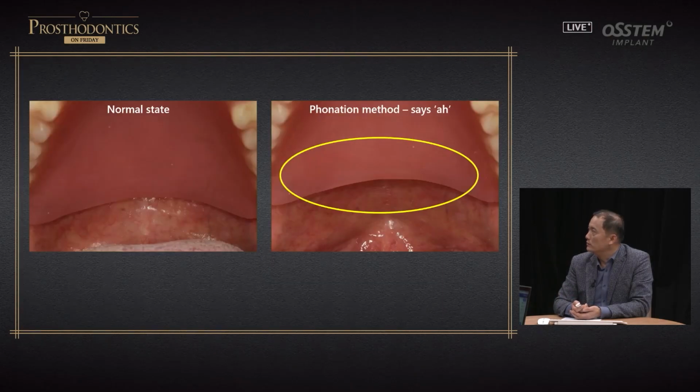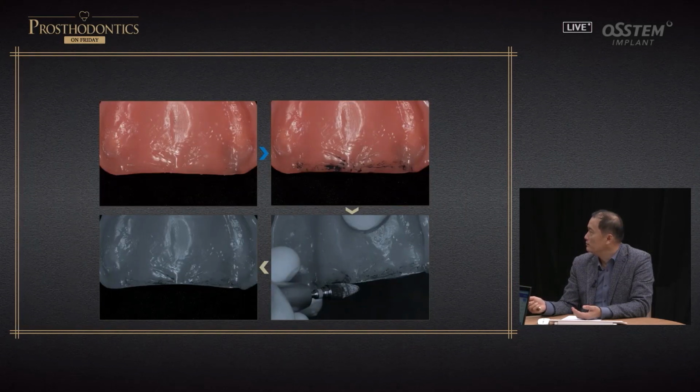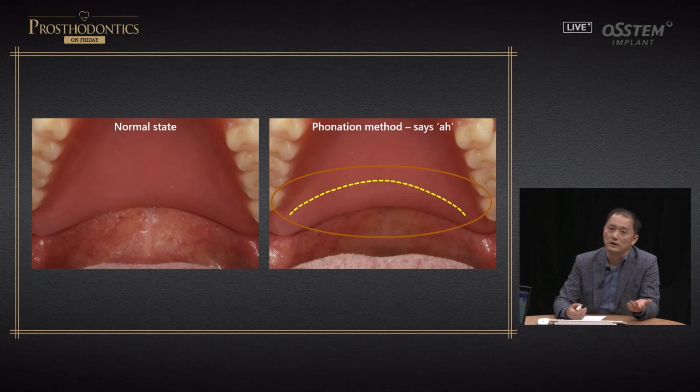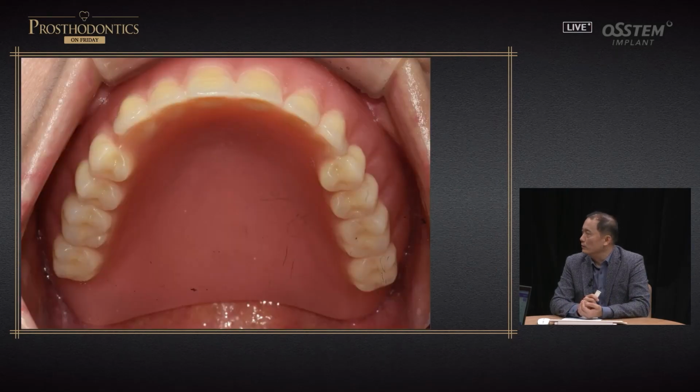So this is the actual patient's case, with the denture. And while speaking, retention becomes weak. In the normal state versus when the patient says ah, air comes in freely. There is a bit of a problem. So the AH line was checked again by marking it, and we took photos and adjusted the area. After this, when I made the patient say ah again, there was less of a gap. So by making it shorter, retention actually goes up. And the patient was also very satisfied.